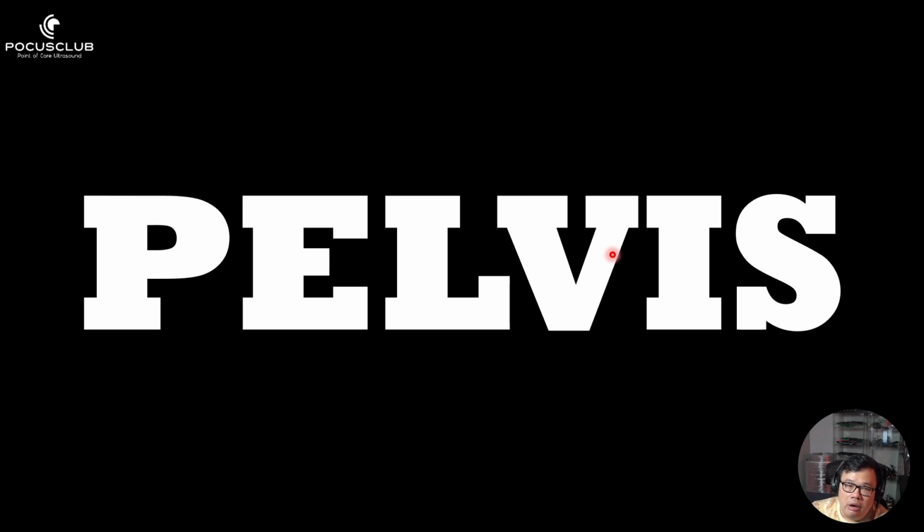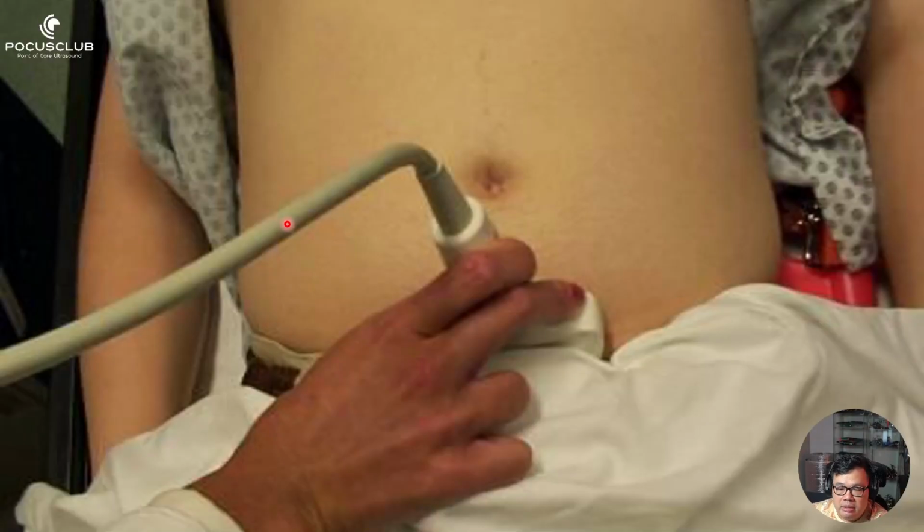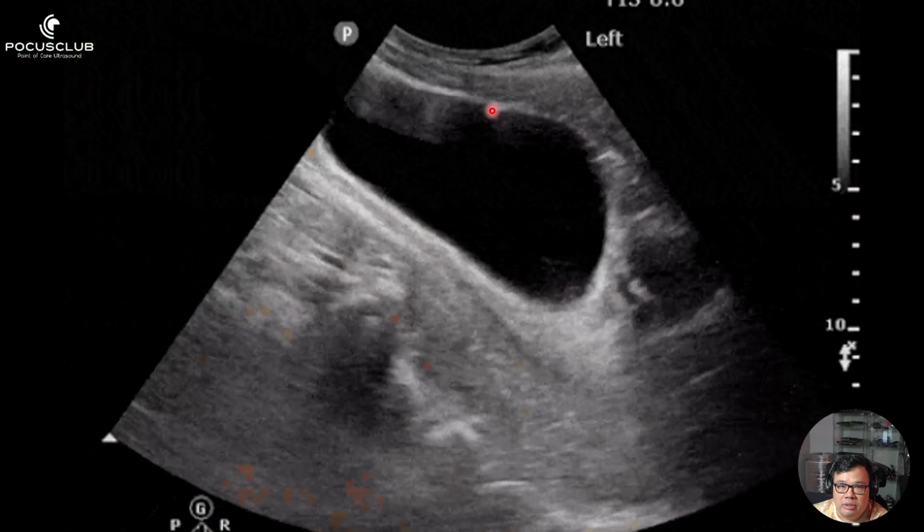So now going on to the next examination. If you had no free fluid in the right upper quadrant, you go look in the pelvis. Okay, so over here you see this is the transverse view where the probe marker is towards the patient's left. But I would prefer that you just use the probe marker facing the patient's head. Okay, so it's a longitudinal view.